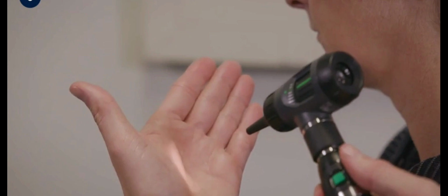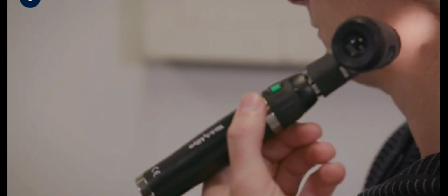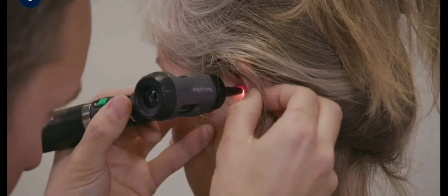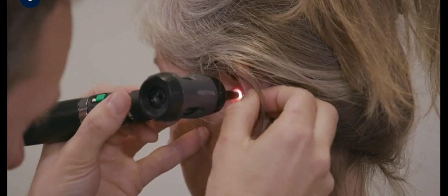For the examination of the acoustic meatus and the tympanic membrane, otoscopy is performed using an otoscope. When the left ear is examined, the otoscope is held in the left hand, and when the right ear is examined, the otoscope is held in the examiner's right hand. Note that the otoscope is held like a pen, between the thumb and index finger. The examiner rests the ulnar side of the fifth digit against the patient's cheek for stability.